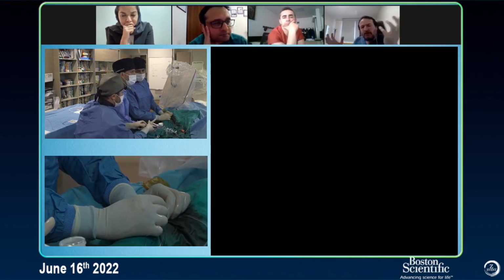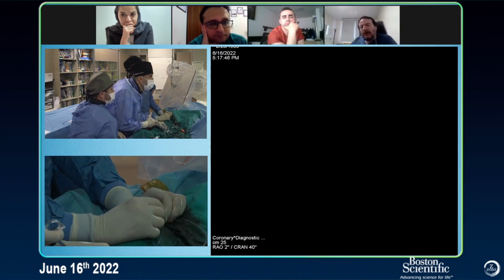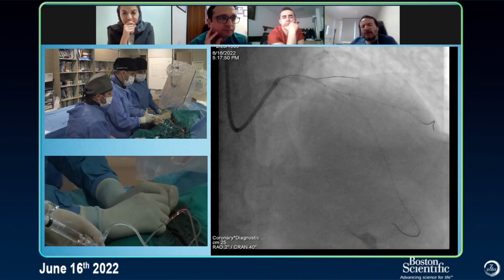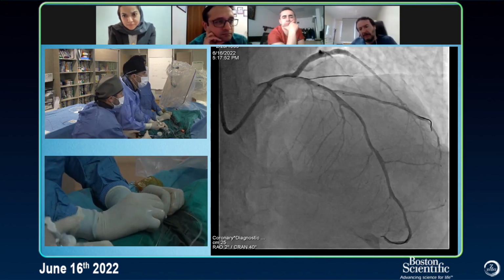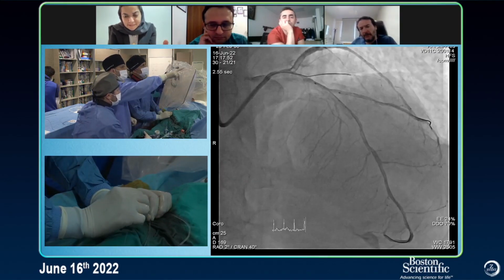You have some kind of skeleton around the vessel. Let's measure it. So it might give you an opportunity to go out without stenting, maybe. Okay, so, this is 15. 15, 28. Yes, this will be fine. 23 or 28.